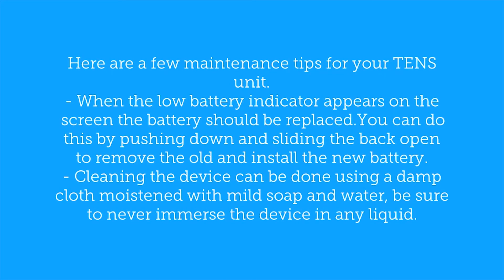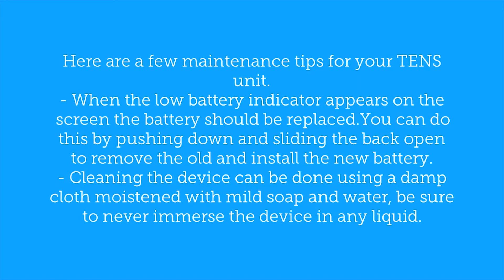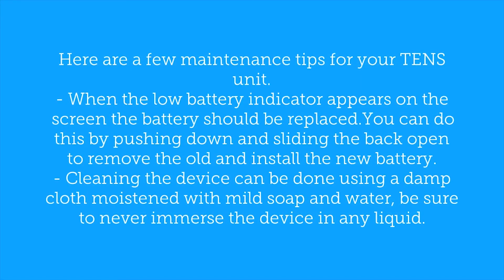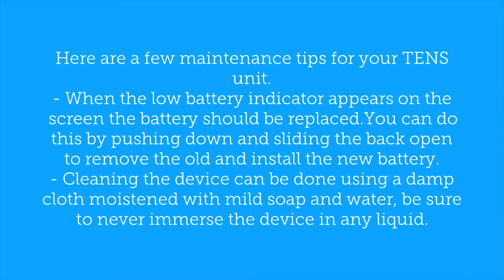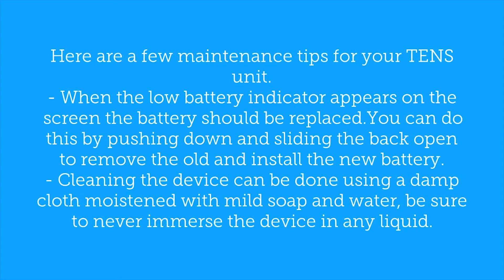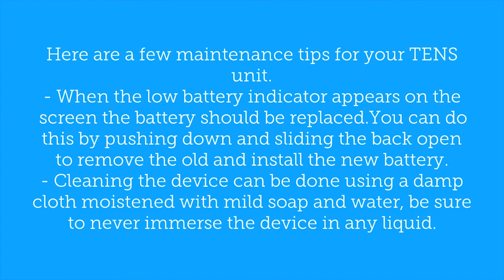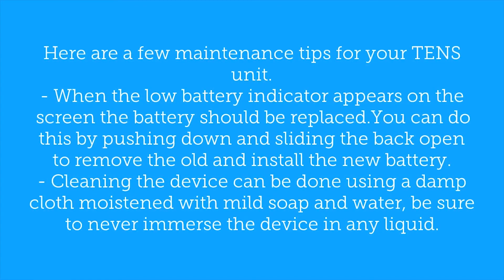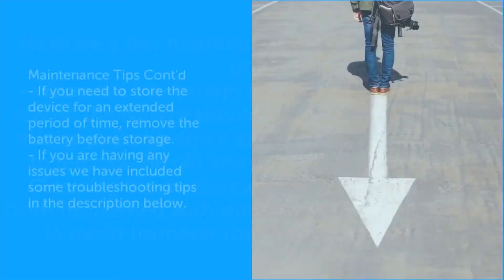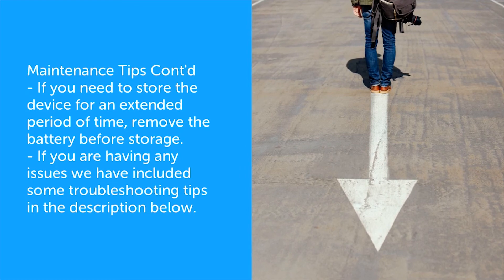Here are a few maintenance tips for your TENS unit. When the low battery indicator appears on the screen, the battery should be replaced. You can do this by pushing down and sliding the back open to remove the old and install the new battery. Cleaning the device can be done using a damp cloth moistened with mild soap and water. Be sure to never immerse the device in any liquid. If you need to store the device for an extended period of time, remove the battery before storage.